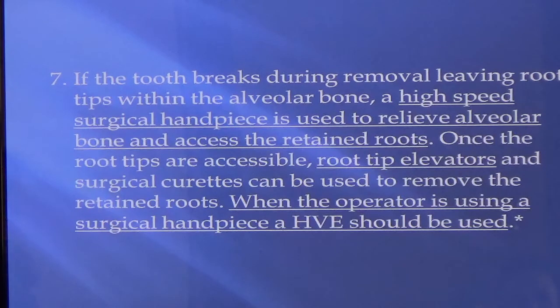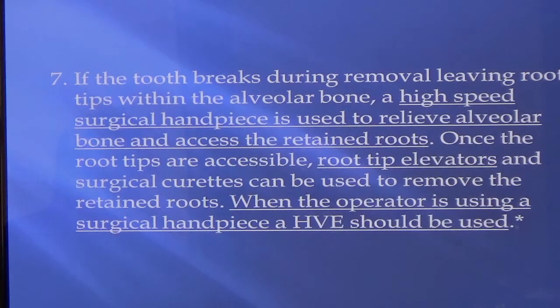So, yeah, if we're using a surgical handpiece, basically, or our handpiece, again, we're squirting water in there, okay? So, and you're cutting away. So you can't use your surgical tip, which is the small tip, when we're using a surgical handpiece, okay? So you need to use your high volume, your regular one with the big opening to suction.